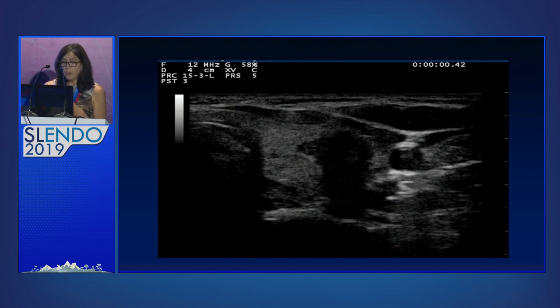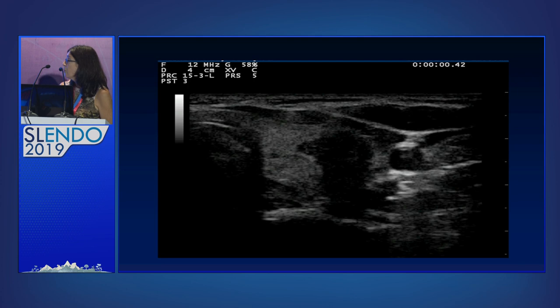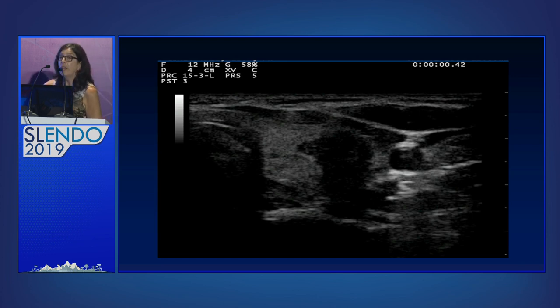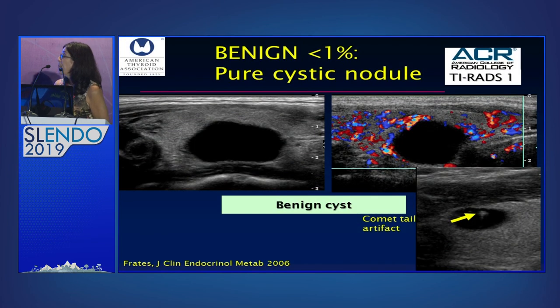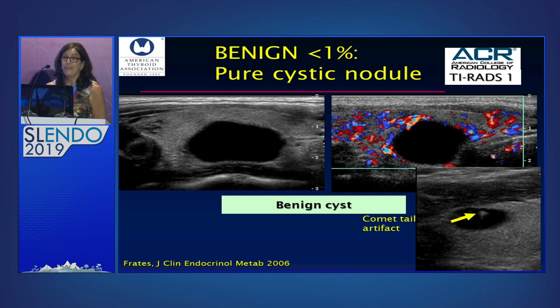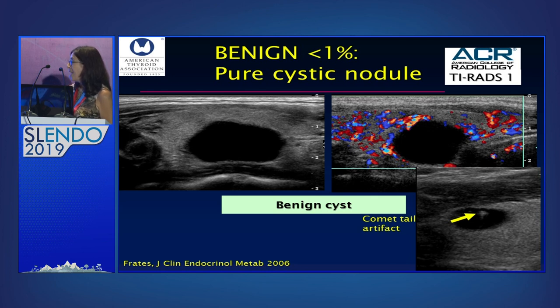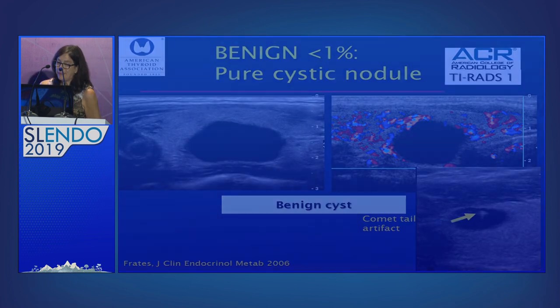Here's an ultrasound image of a spongiform nodule. You can even see some comet tail reverberation, and you can see that many of these echogenic areas are generally quite linear and are behind the cystic areas. Microcalcifications are virtually always found in hypoechoic solid nodules. The last ultrasound appearance is the pure cyst — these are benign, and we certainly don't biopsy them unless doing an aspiration and possibly ethanol installation for symptoms. Here's the comet tail in the pure cyst.